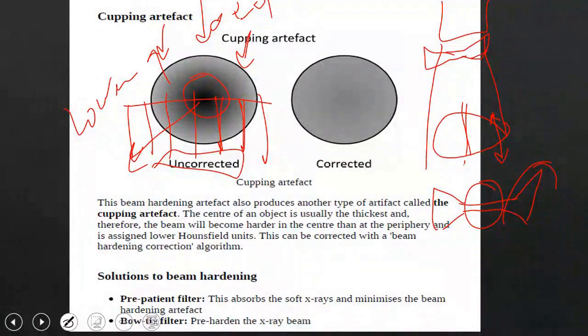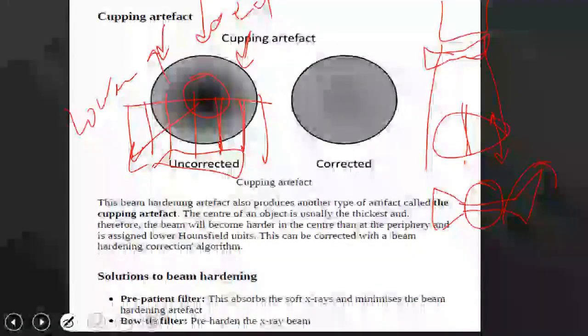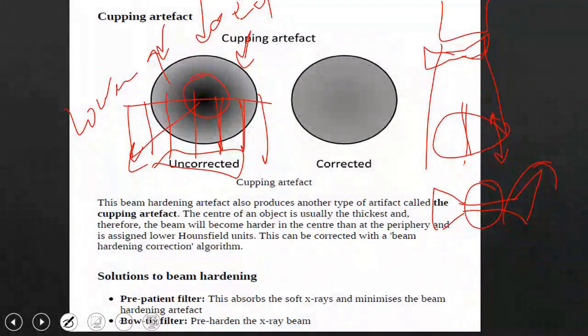When you come to image the water, this particular phantom is placed directly within your field of view. There exists both a part located within the peripheral field of view and also a part situated at the center field of view. What it does essentially is teach the detector about the signal it will receive from various thicknesses present within the different sections of this specific type of water phantoms.